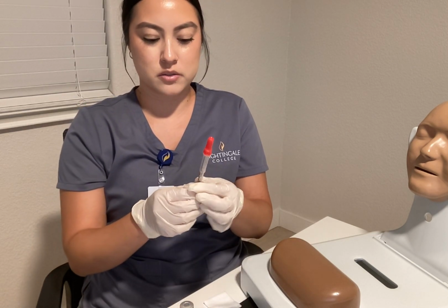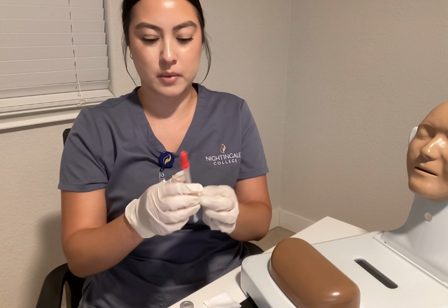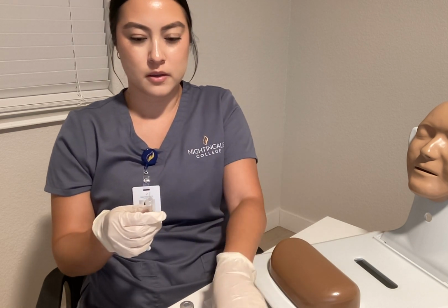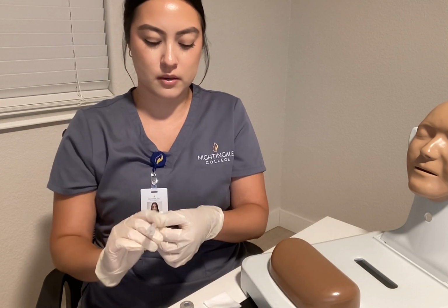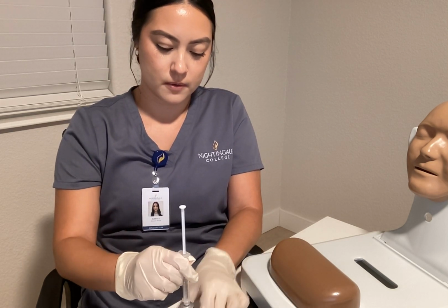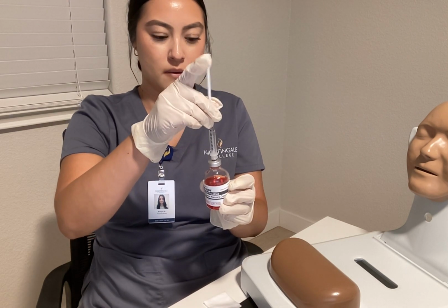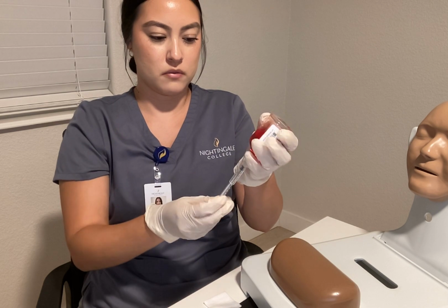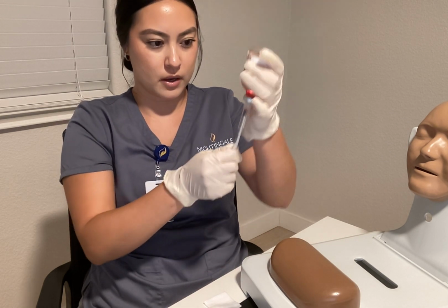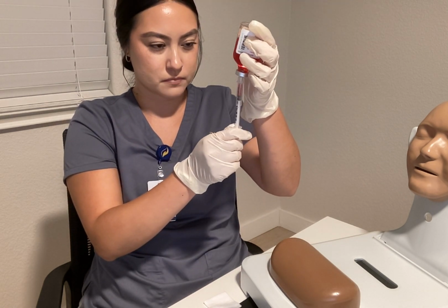Again, we are going to inject the 1 ml first. And I'm going to leave the cap here so we could do capping after. So once we have that injected, we're just going to inject the air, invert, and then pull out the 1 ml.